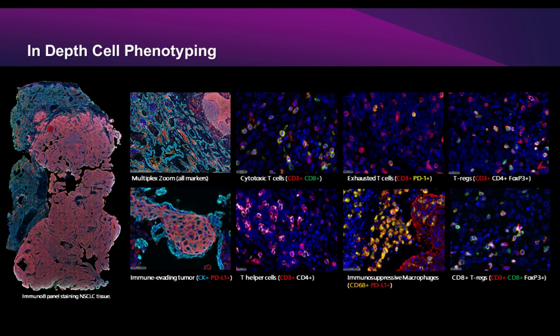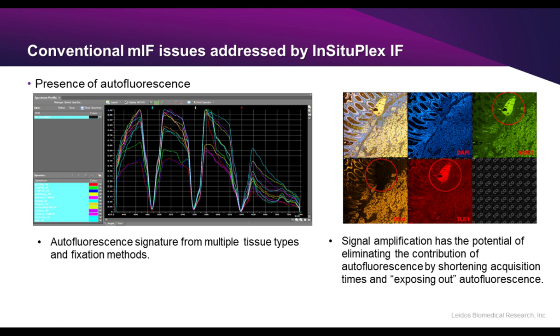Yeah, and I concur. With Katir, I think if we looked at that one slide that I had with the representation for the autofluorescence, what we see is that with these amplification technologies, the signal can generally overcome a lot of autofluorescence that's present in the sample, and you're going to still have issues with folds and all those kinds of things with artifacts of sample handling and sectioning.